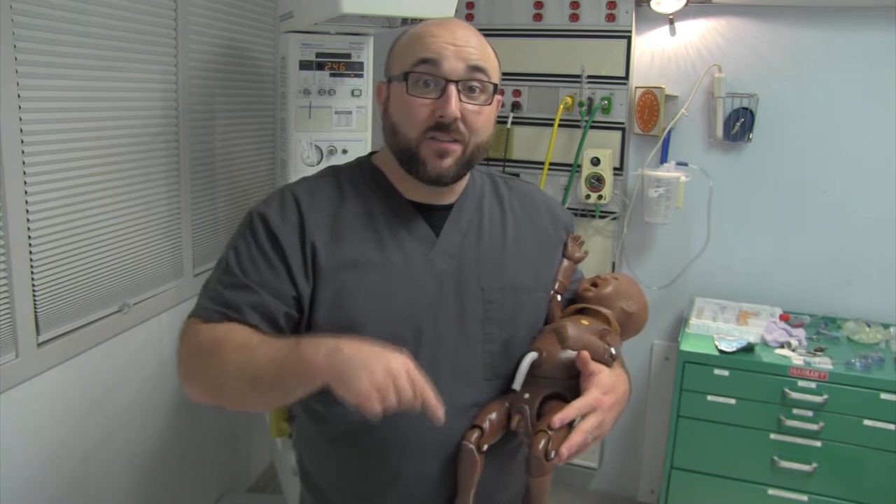What's up today guys. I'm doing some training for the neonatal outreach program through our local simulation center. With the outreach program we do training for rural hospitals in their emergency departments specifically for those high acuity, low volume situations where a mom comes in, delivers, and there's possibly problems with the delivery and with the neonate, so they have to do resuscitation. This section is going to be about taking care of the airway.